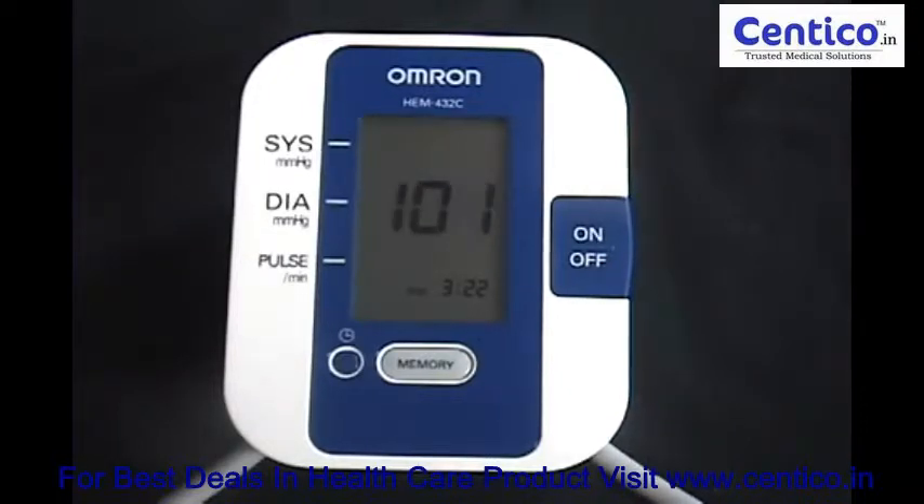When everything is ready to go, just pump up the cuff until the pressure reaches about 180 to 200. Then let go of the pump and the air will release slowly while the sensors inside the cuff will measure your blood pressure. You can see that everything is working because of this flashing heartbeat symbol on the screen.